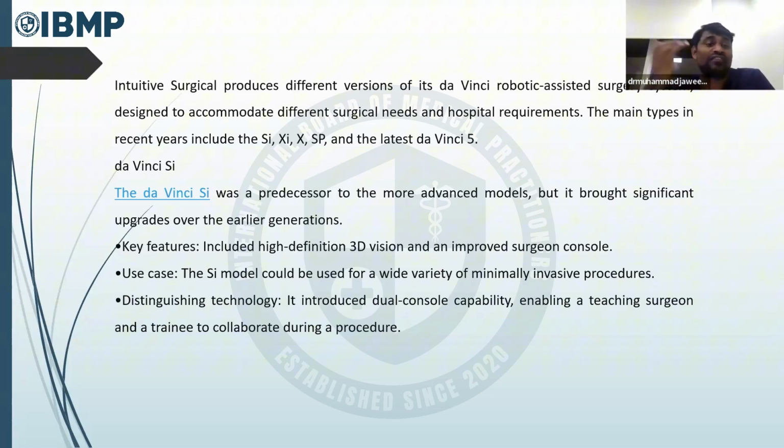Now, starting with Da Vinci SI. What do you mean by Da Vinci SI? Da Vinci SI was a predecessor to the more advanced models, but it brought significant upgrades. What are the upgrades? High definition 3D vision and an improved surgeon console.